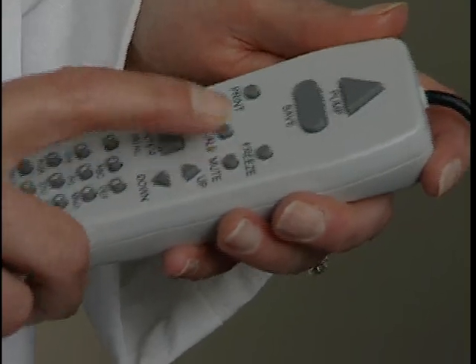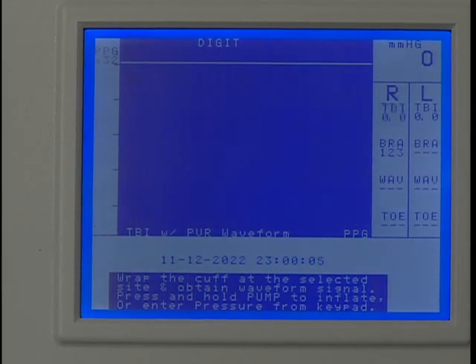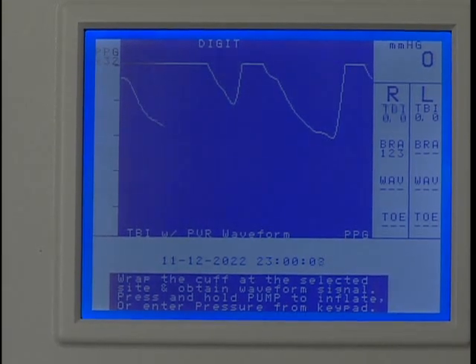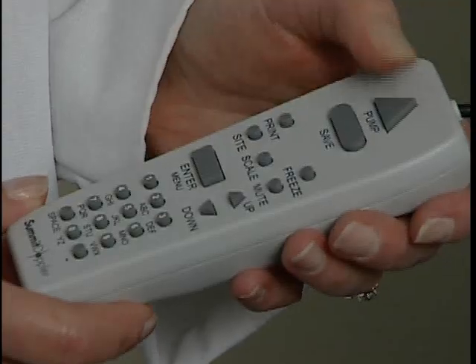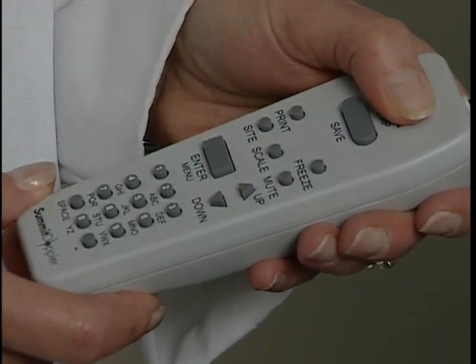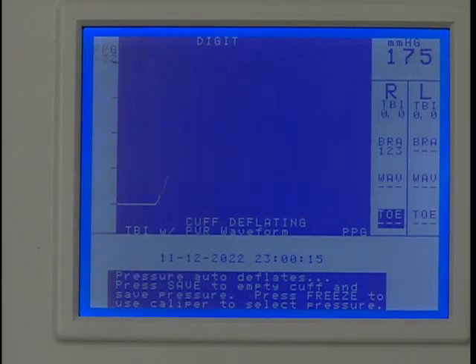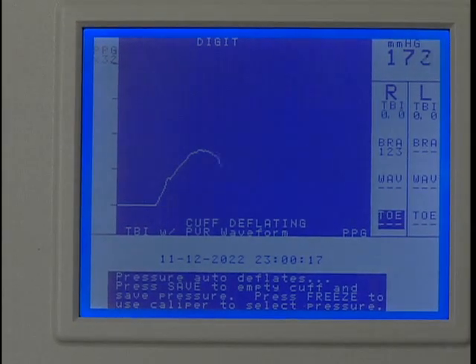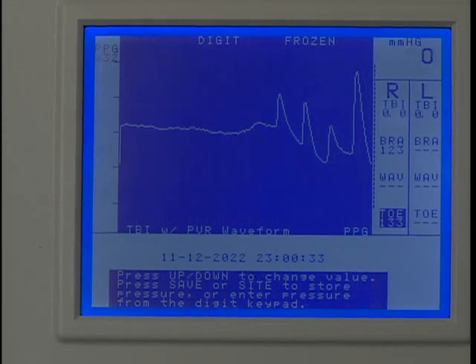Press Scale one or more times as needed to adjust the vertical scaling to obtain a waveform as large as possible without clipping at the top. Once an optimum waveform is viewable on the screen, press and hold Pump until the PPG pulsations disappear. Release the pump and the cuff will automatically start to deflate. Press Freeze after several pulses have reappeared.